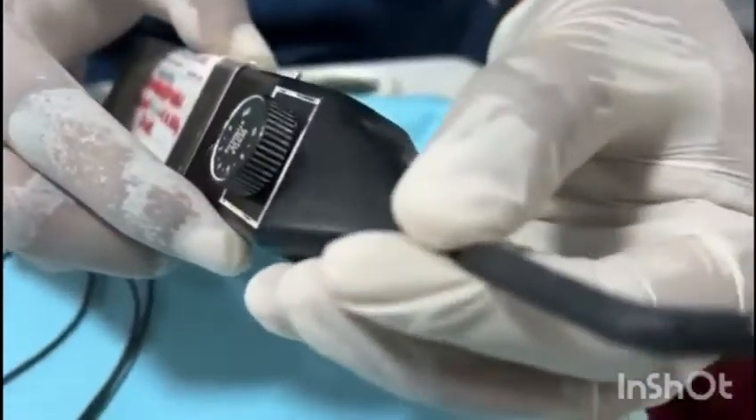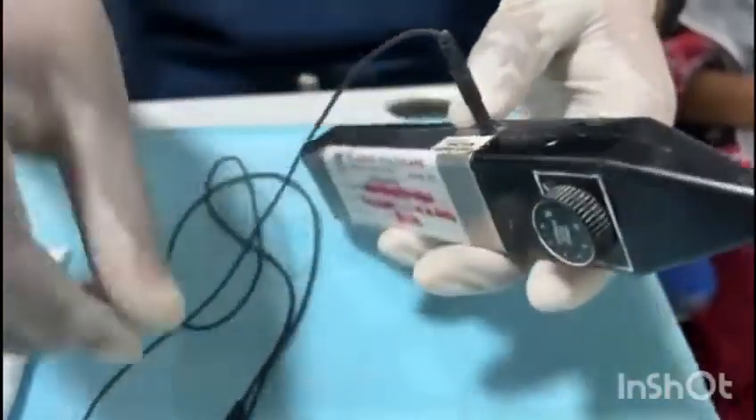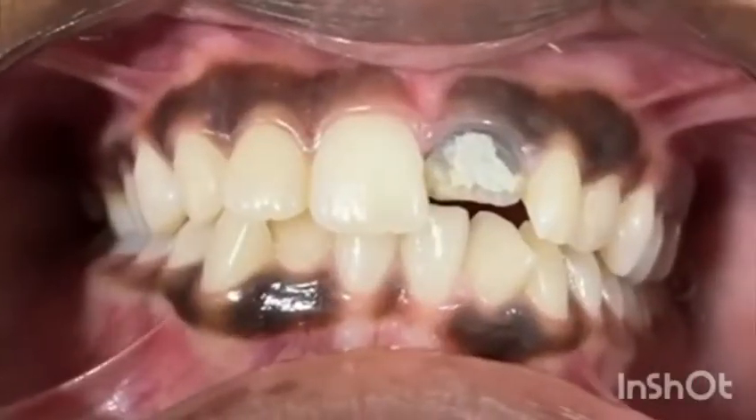Before commencing the procedure, the lip clip and the probe are inserted into the main device. The whole procedure has to be explained to the patient and then only started.